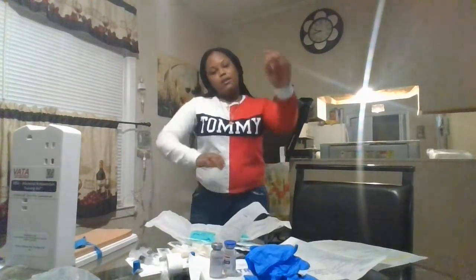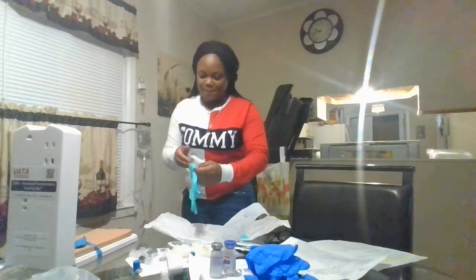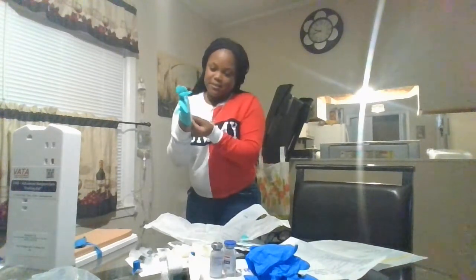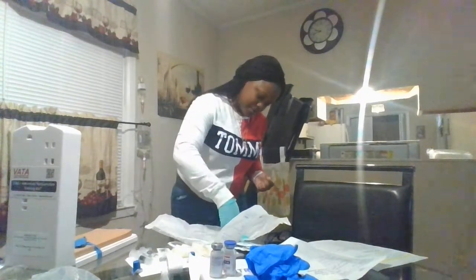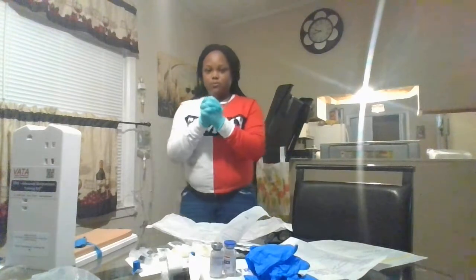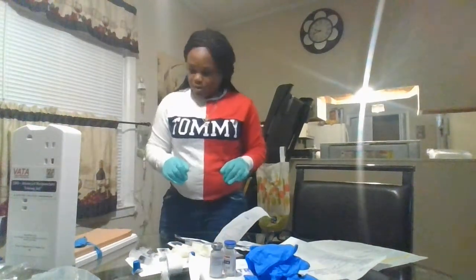My dominant hand is my right hand. Making sure I don't cross my sterile field.